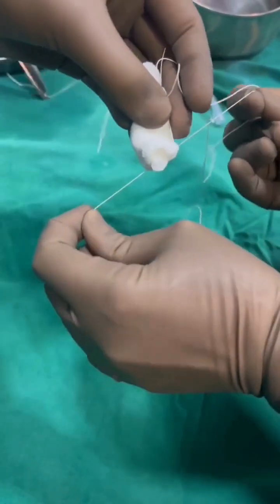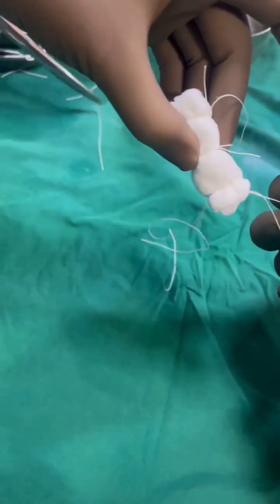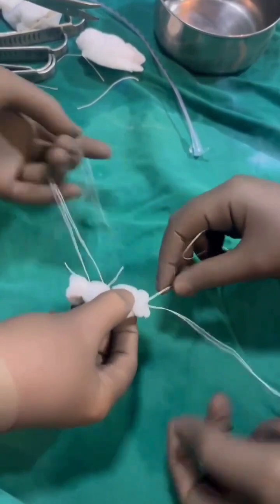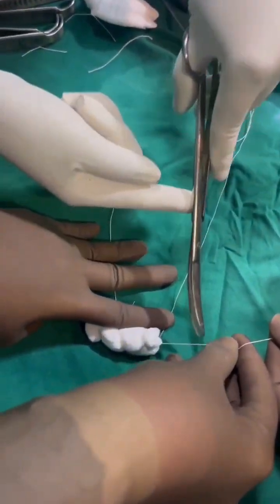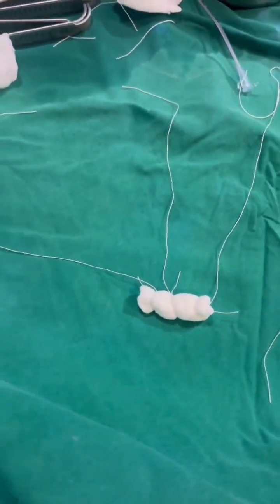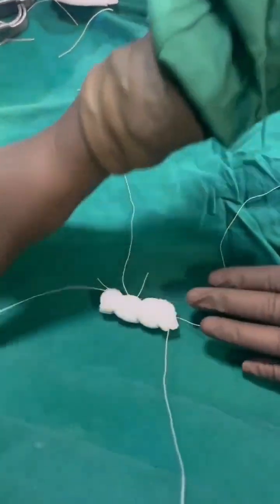Before packing, we have the pack ready. We put it on the trolley — the center thread is kept on one side and the two threads are kept on the other side. So now we have a bolster with three threads: two threads on one side and the central thread on the other side.